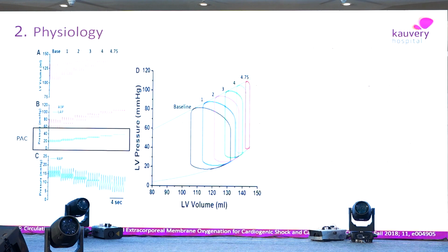So when you institute ECMO, it can be stressful because you are acting against the heart. You are putting all this blood into the aorta, so that is actually increasing the SVR for that particular heart.